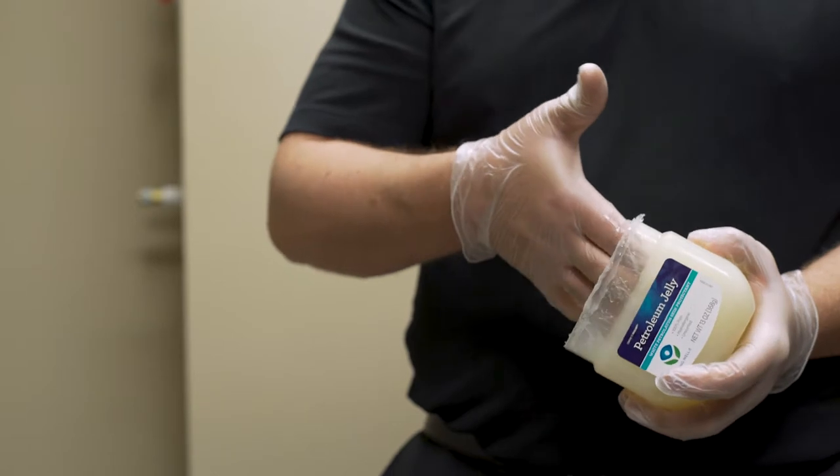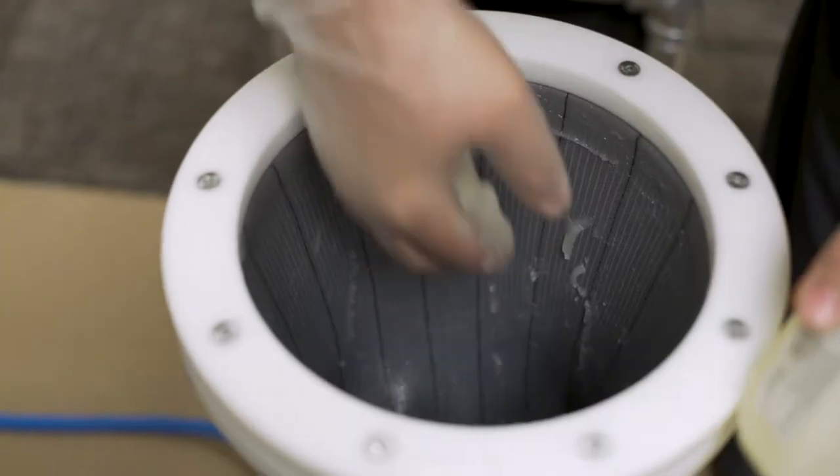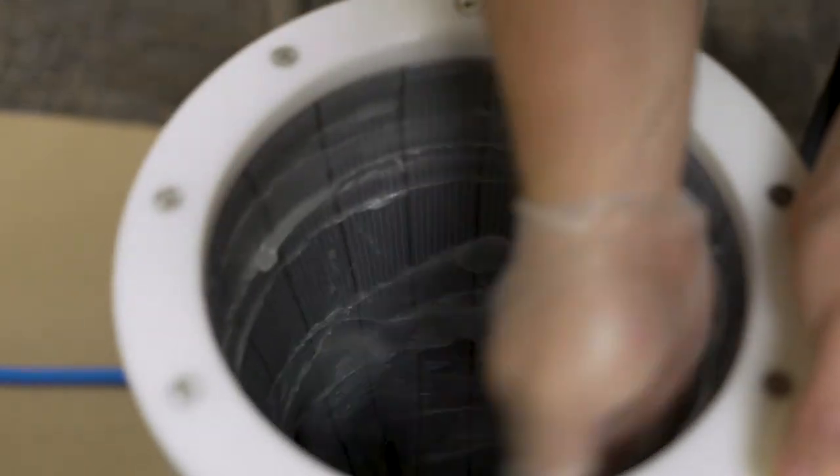At this time, you'll be utilizing Vaseline to smear on the inside of the membrane. It will require about a handful or more of Vaseline. It has been noticed that success has been better when more Vaseline is used.